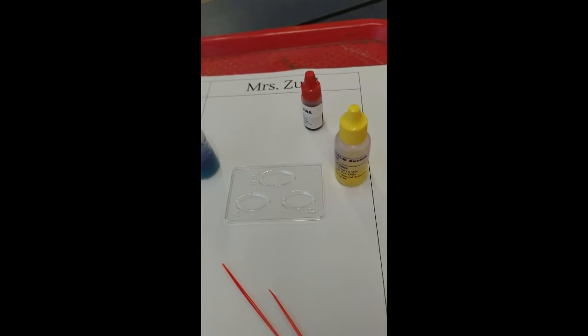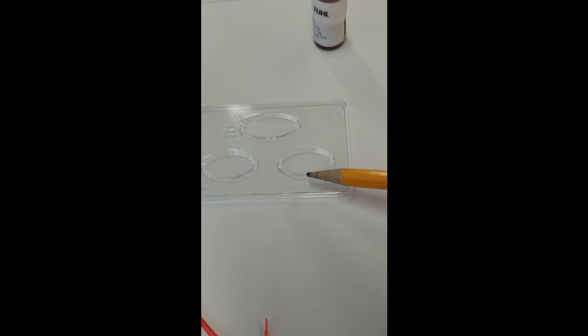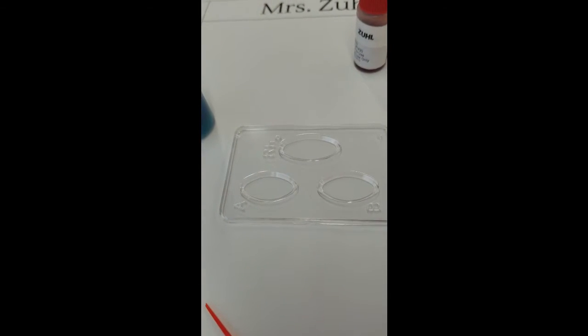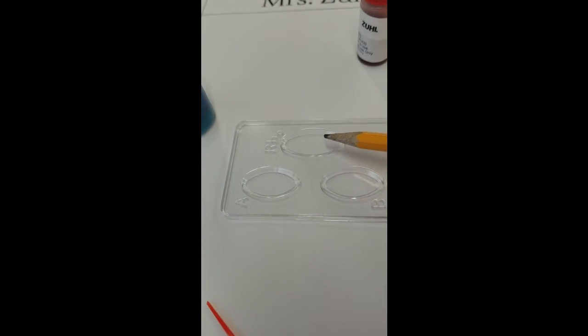So this is your lab setup. You have this tray. Now see how there's an A on this well and a B on that well. This is where you're going to put the anti-A, and this is where you're going to put the anti-B serum. This well says RH, and that refers to the positive and the negative that sometimes you hear about your blood. Like you might hear someone say they are A positive, or B positive, or O negative, or whatever. We're not going to test the RH, so you leave that well blank.